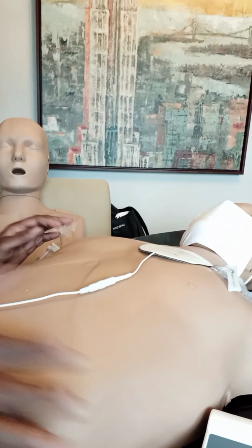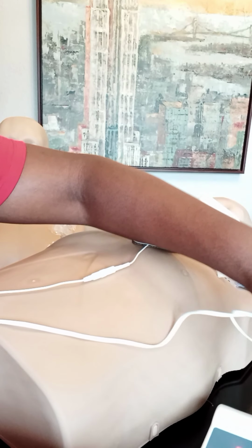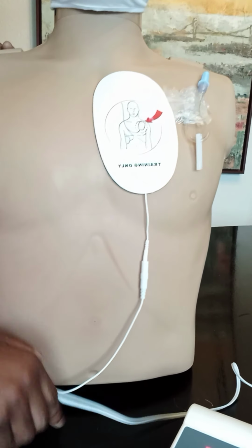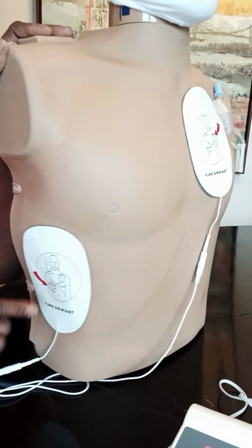Apply pads. Insert connector. Make sure that it's on firmly. It's sticking very well. And we're going to insert the connector here. There you go. Analyzing heart rhythm. All right, so this is what we look like. Do not touch the patient. It's not over the catheter itself. It's on the side of the catheter. And shock advised.